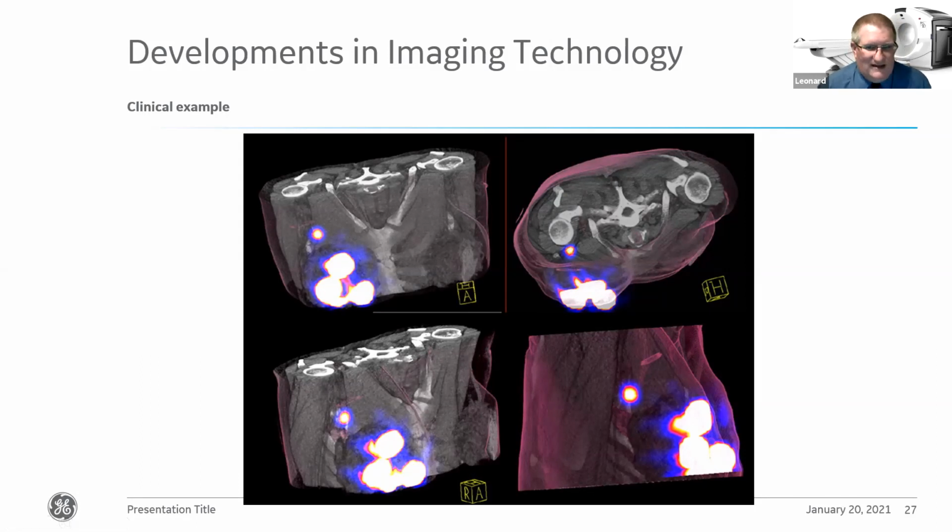And certainly in this example, we've got patients who've had breast cancer and we're trying to pick up exactly where that might have spread. They've had to do radical resection previously, which has led to problems: they might have decreased motion within their arm, decreased mobility. They can also get lymphedema and further problems. Now by attacking specific nodes, we can manage those patients more conservatively, and there's a better prognosis all the way round.